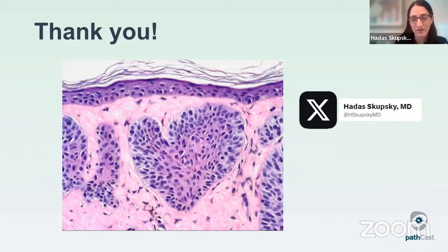non-inflammatory non-scarring alopecias. So, for example, your alopecia areata has a really prominent telogen catagen shift, almost like 50%. Whereas in your scarring alopecias, your catagen telogen shifts are usually not going to be that high. You're not going to have that much of a catagen telogen alteration of your cycle. But you'll still have some catagen and telogen hairs, and in some forms of scarring alopecia, like eventually, trichotillomania and traction become scarring over time. So it's kind of an overlap area. And those you certainly do see telogen and catagen hairs. So I hope that answers that question, but let me know if it needs clarification.